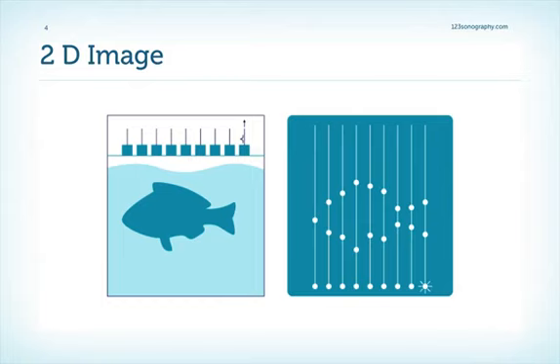We have to understand the principles. In the previous chapter, we discussed how the ultrasound wave is reflected when it hits a boundary. But how can we now build an entire image with the help of ultrasound? Well, to do that, we need not only one transducer or one crystal, but we need several, many as a matter of fact. And each of these crystals fires a beam and then waits if a reflection and when the reflection returns. And it does that one after the other successively.